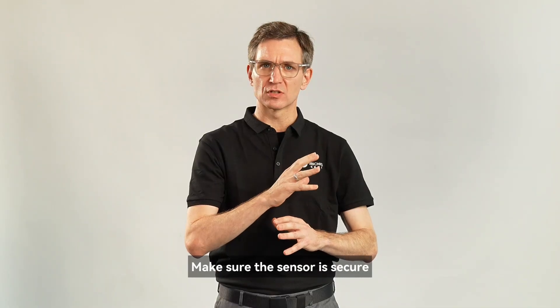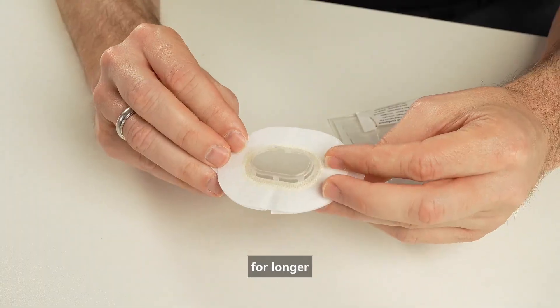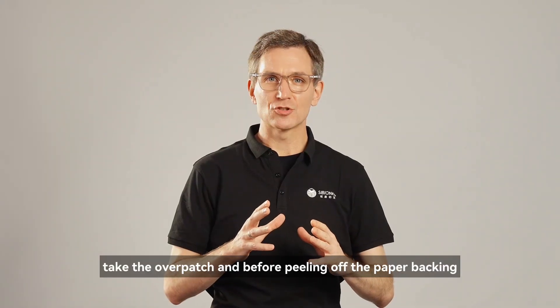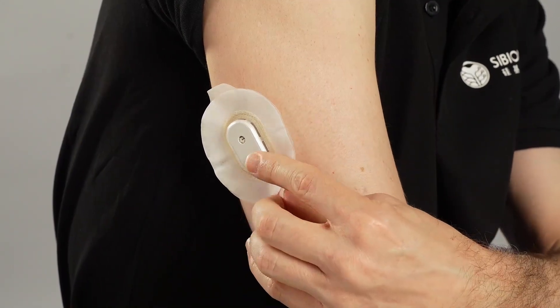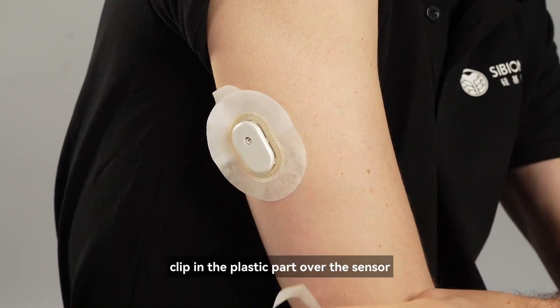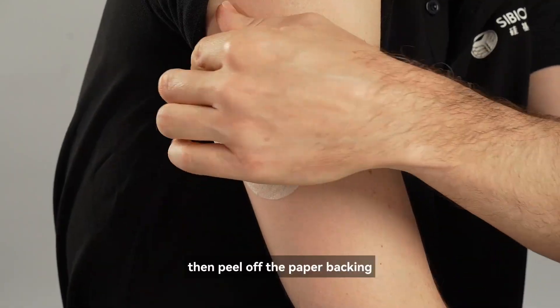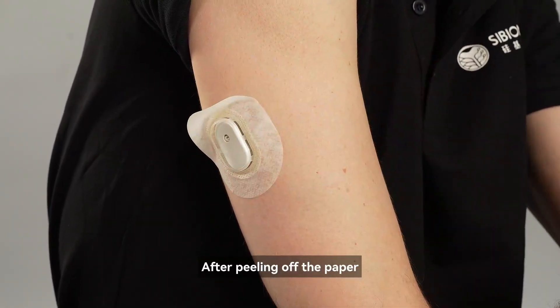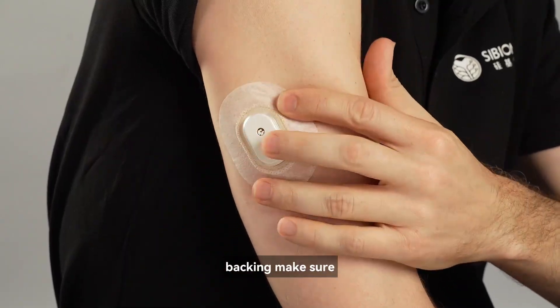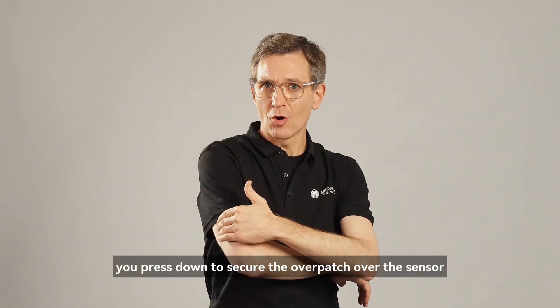Make sure the sensor is secure. We also provide an overpatch to help the sensor stay on for longer. Take the overpatch and before peeling off the paper backing, apply it on top of the sensor. Clip in the plastic part over the sensor and when secure, then peel off the paper backing.